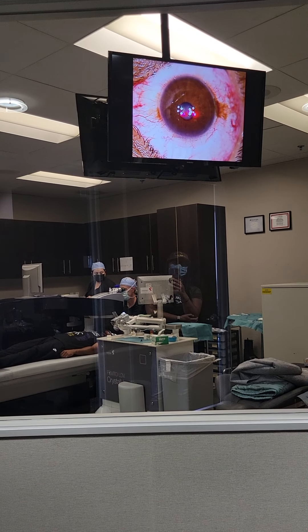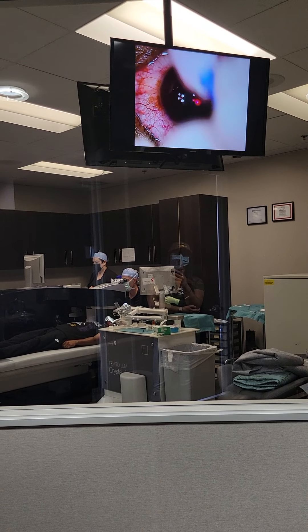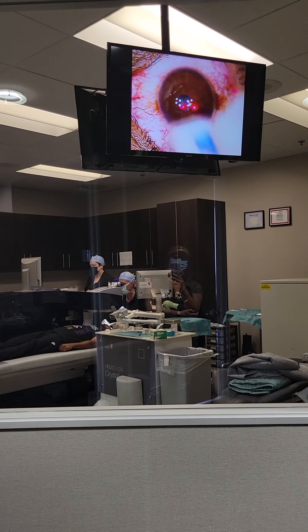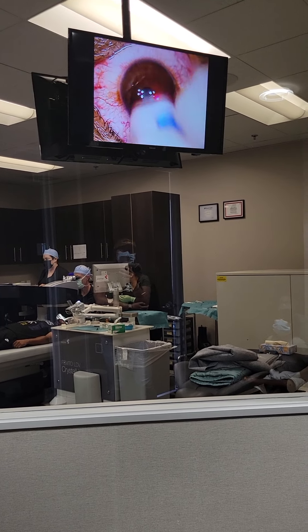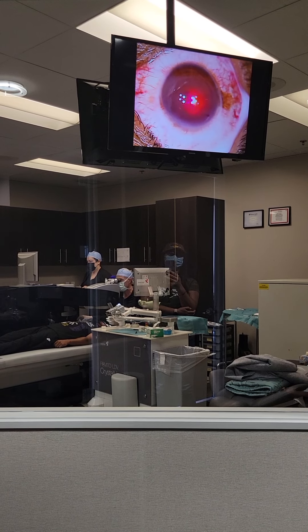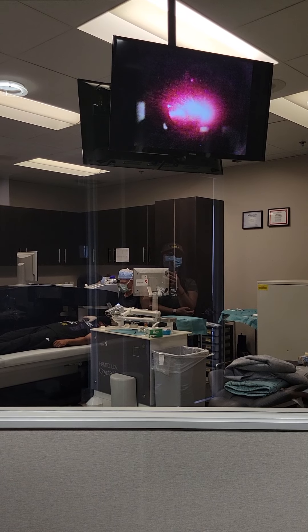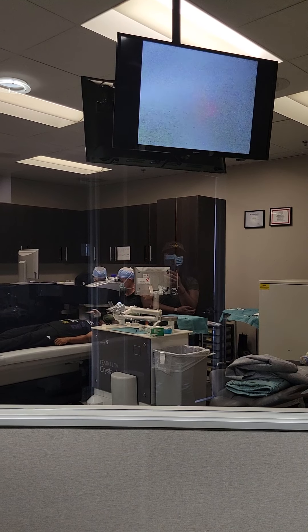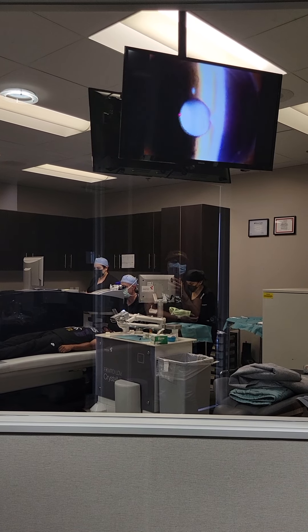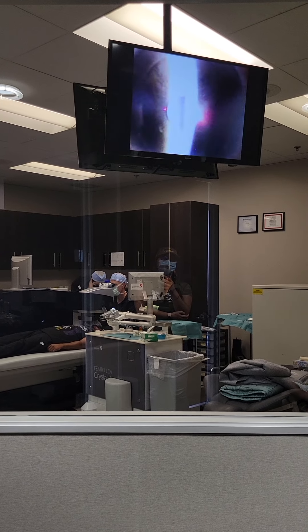Smooth it back on? Your eyes are red. Are those the wings? I watched a video of how long you can stop blinking — and in one week you'll be paralyzed. Wow. Do they move eyes? I don't remember. I don't think so. I think it's the same one.